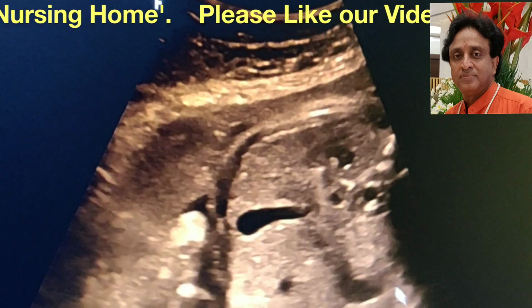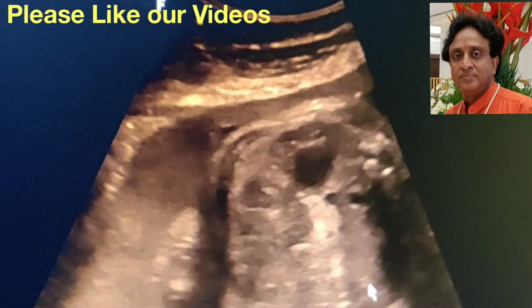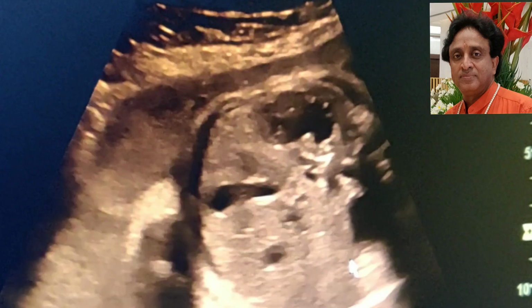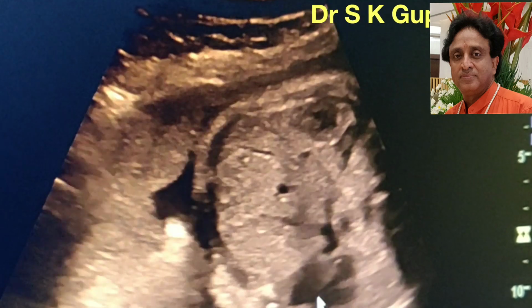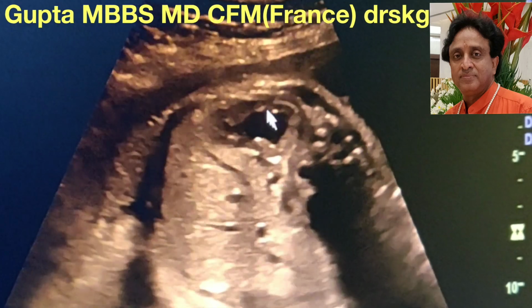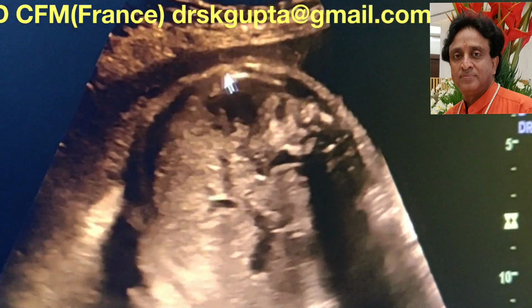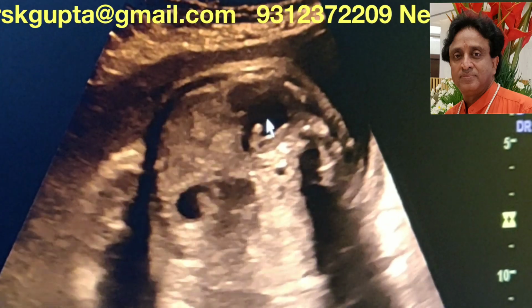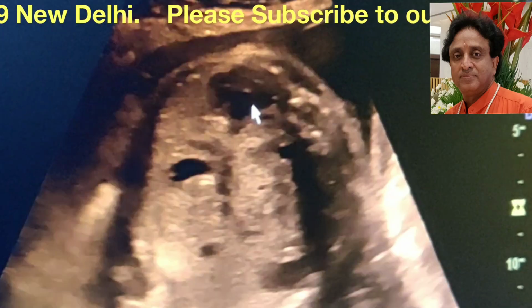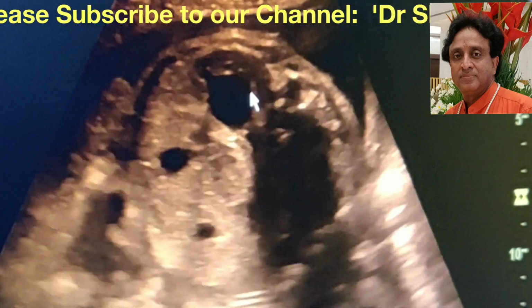This is the stomach. You can see the stomach on the left side, and this is the heart again. You have defined that this is the left side and this is the right side of the baby. And now if you see carefully, this is the kidney, and the kidney is showing marked renal dilatation, marked pelvic dilatation, and the whole kidney seems to have been dilated.